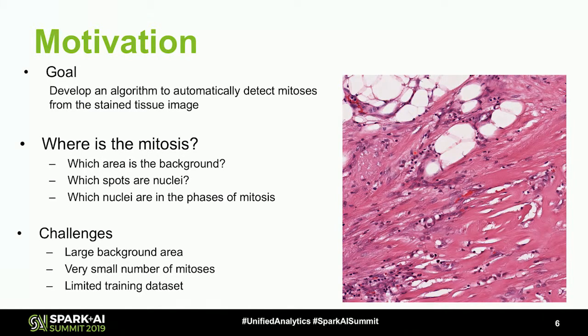The third question is which nuclei are in the phases of mitosis. There are four phases during the development of mitosis. Each phase has different size, shape, location, and texture. And many normal cells have a very similar appearance to the mitosis.